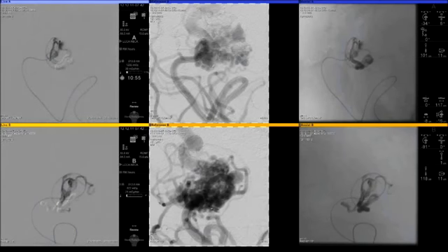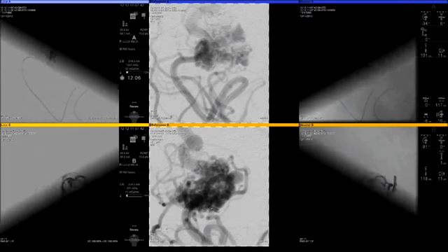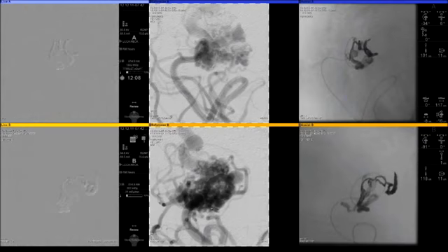And the other important aspect is that the larger pedicles will in general allow you to have a safer catheterization. So those are very important, easy initial thoughts you have to have when you choose the area that you're going to be catheterizing or approaching the AVM. Patience is key, and the use of blank roadmaps is very important as we gradually build.